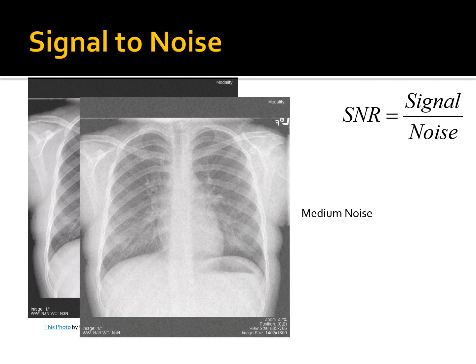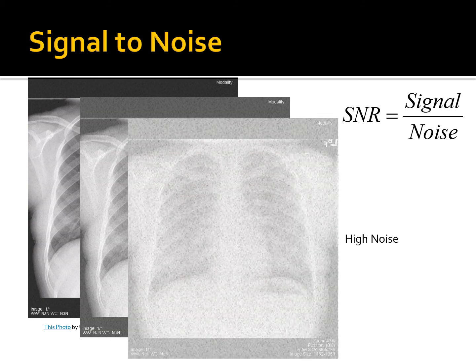When we again double the noise, there is a marked loss of contrast. It is very evident that lung markings are being obscured by the noise. Finally, here is an extreme amount of noise applied to the image. Notice how lung markings and even some of the ribs are not visible as on the initial image.